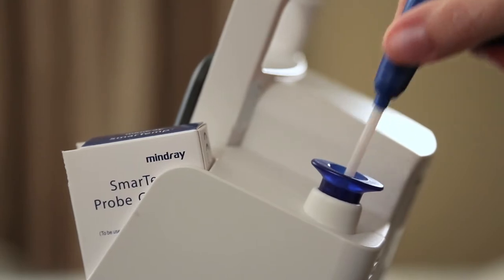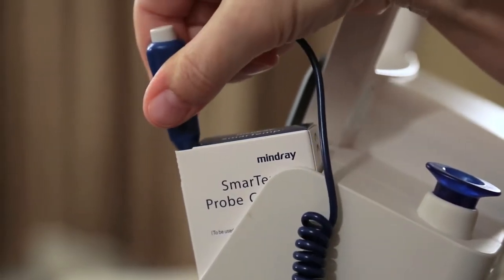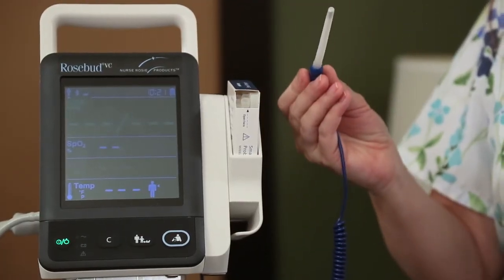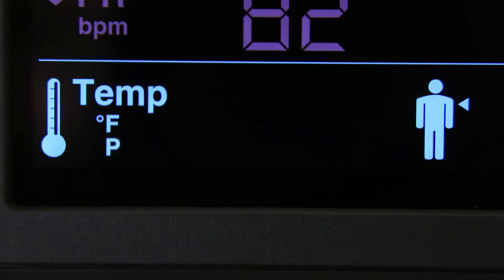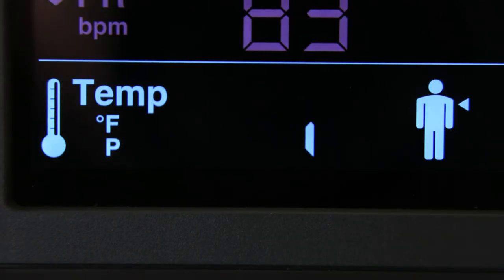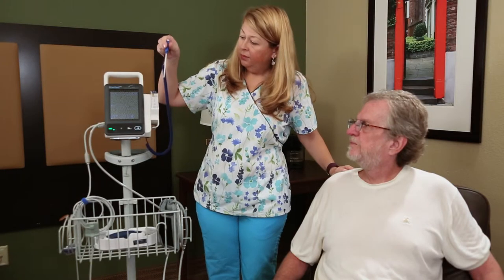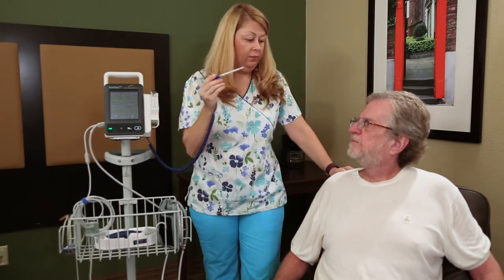Remove the temperature probe from the probe well and insert it into a cover in the probe cover pack. Press the probe handle down firmly until the cover engages with the probe. The temperature module starts to warm up when the probe is taken out of the probe well. The warming up time is about 2 seconds at room temperature. The monitor sounds 2 beeps and the temp parameter area displays 2 dashes when the warm up is complete. When taking an oral temperature, apply the probe under the patient's tongue from either side of the mouth.